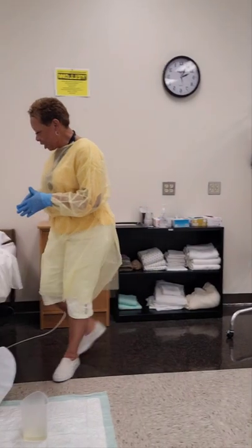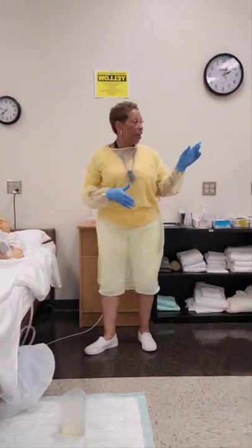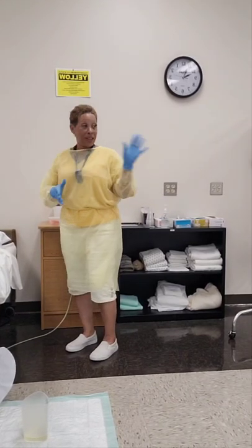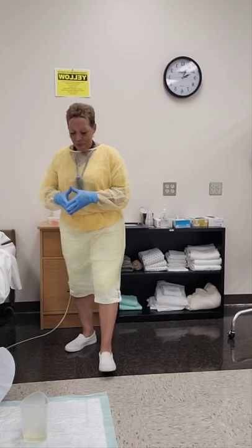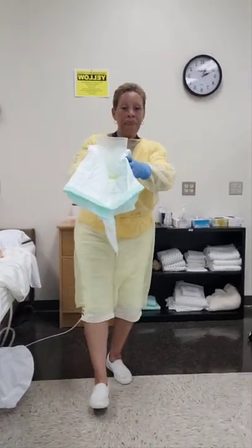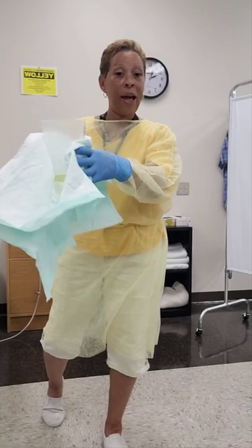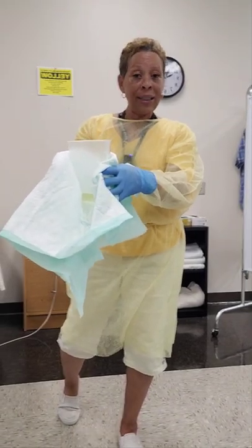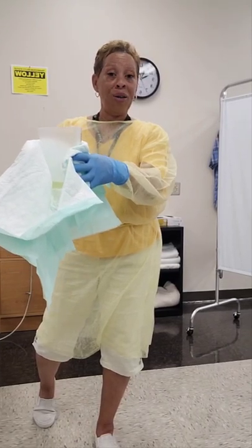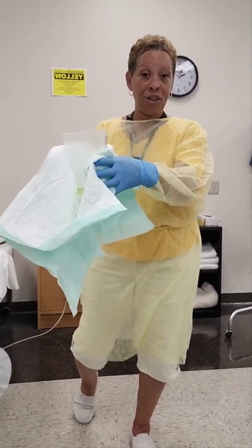Your bed is still in a low safe position. Bed wheels are still locked. You still have your call light in hand. Would you like me to open your privacy curtain or keep it closed? I'll keep it closed for you. Now I'm going to collect the clean barrier and the graduate and take them to a hard level surface. During testing, the nurse aide evaluator will instruct you on what hard level surface to place the container to measure it.